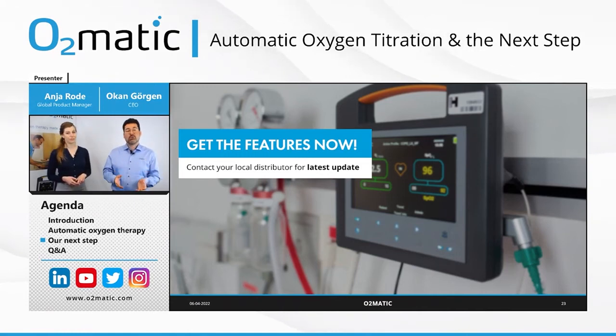If you have Automatic Pro already and you are in doubt whether you have these features or not, you can turn on the device, press admin, and look in the lower right corner. If the version is older than 1.6, then you probably don't have these features. So please reach out to your local distributor. If you don't know who that is, contact us, and let's make sure that you have these newest features.